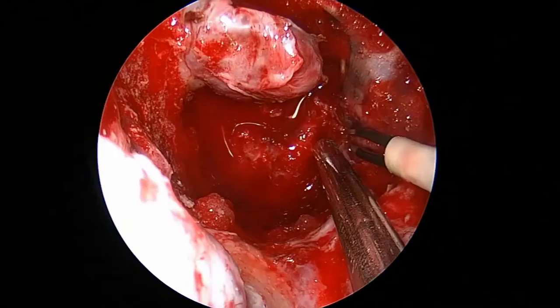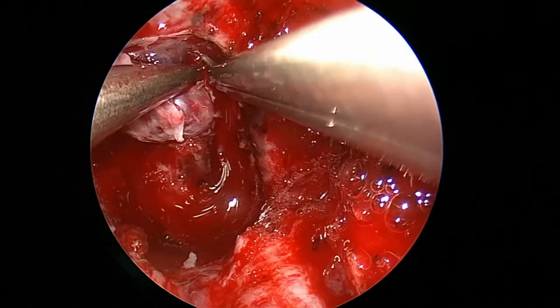Here we coagulate the caroticoclival canal periosteal layer to get extra space. And here we open the dura right where the tumor is arising from.